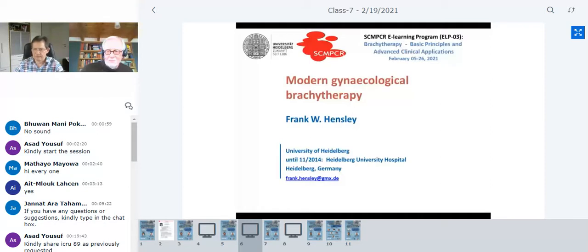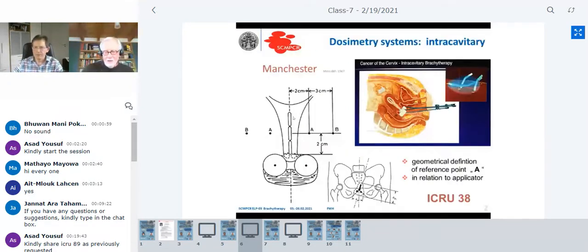I want to speak about a few more theoretical things, more about the concept. I will repeat a few of the things that Dr. Schwickert has just been telling you, maybe with other words, and maybe that is practical, because I think it's very important that you understand the concepts behind the targets that are used and the way the procedure is done in gynecological brachytherapy. So hearing things twice with different words may be practical, I hope.